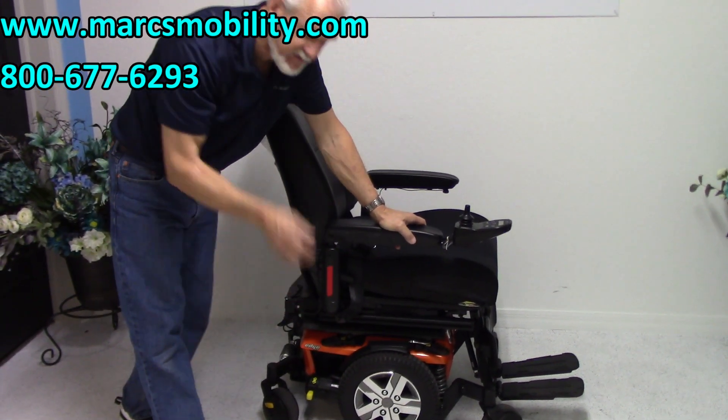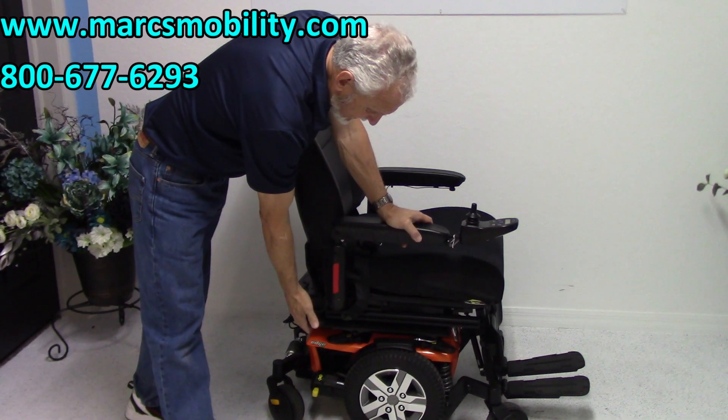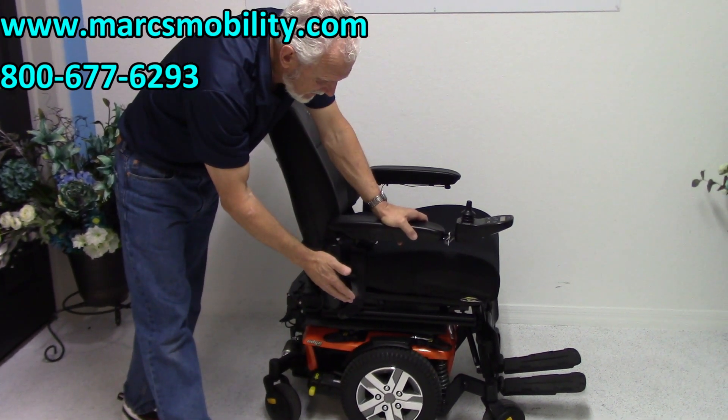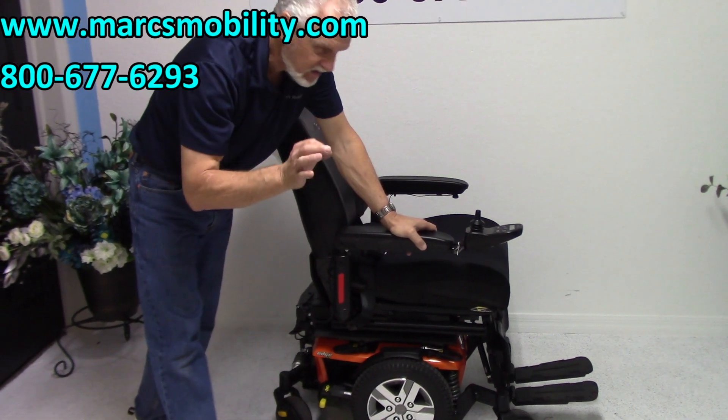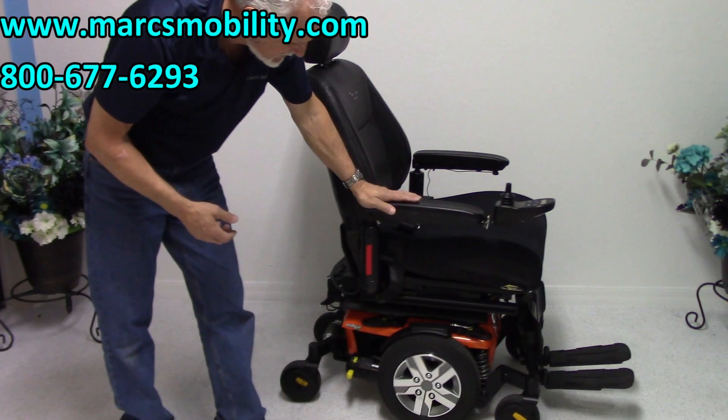The Quantum Edge base, which is very rare that you will find this chair like this with this base, because that's the good base, with only the seat lift. But if that's all you need, you need to look at this one. This one has got what's called a 12-inch seat lift.